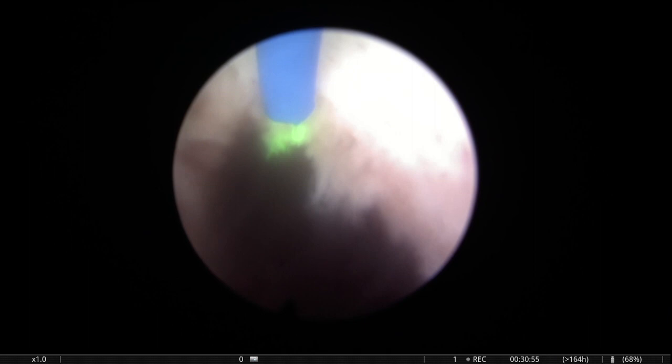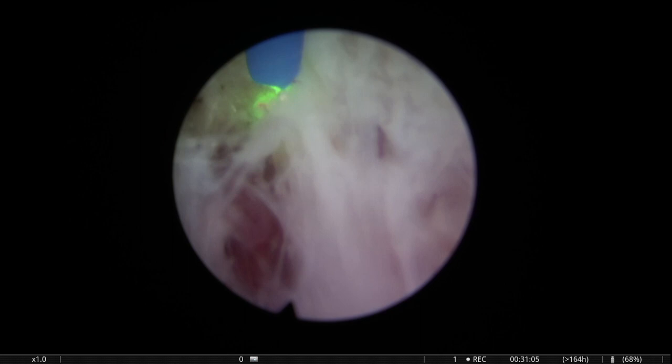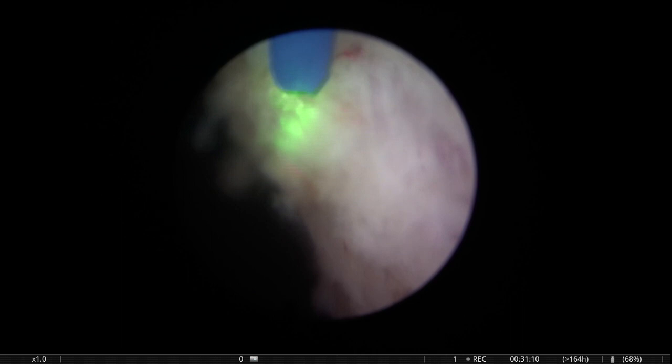So this is the bladder neck anteriorly. We had done an entry into the bladder, and now we have to cut the bladder neck fibers. Here, I think, is where the low power falls a little bit short. When you have to cut fibers, it's very boring. It takes a while. You have to be very patient.